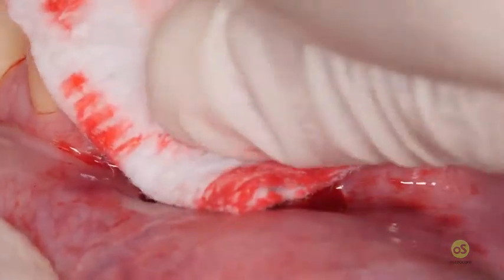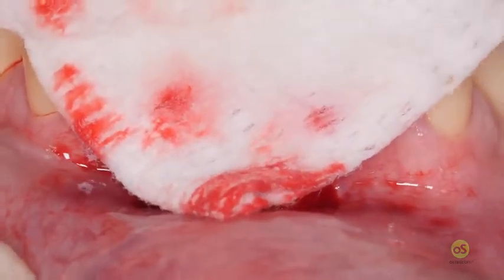If the graft is a bit thicker in the peripheral area, you can also reduce it a bit.